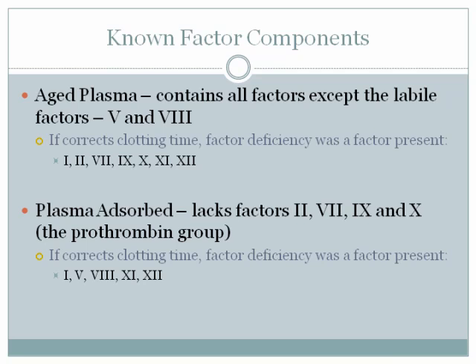Prolonged PT, prolonged APTT, serum, no correction, aged, no correction, adsorbed was the only one that corrected.